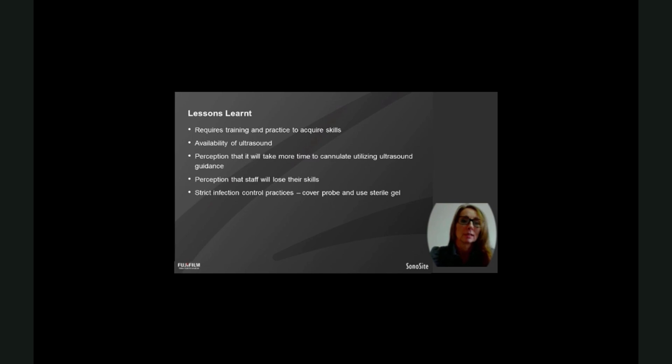It's important that you recognise that this piece of equipment will be used between multiple patients, and you develop strict infection control practices within your unit with regards to use between patients, recognising that you're using this to puncture a vessel and that there's a risk of transmitting infections and bloodborne viruses. So you need to be covering the probe, disinfecting appropriately, and making sure that you're not increasing the risk of infection between patients.